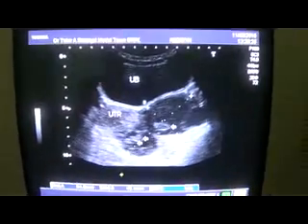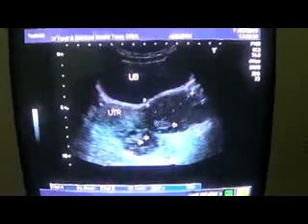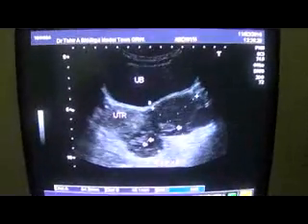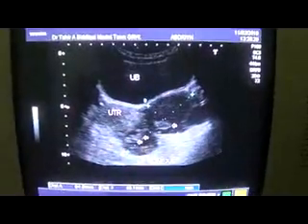Now you see this, I have frozen the pathology. The patient is very tender in the region of the left adnexa. The patient is tender to the probe, can't hold the pressure. You see the dependent region echoes are seen.